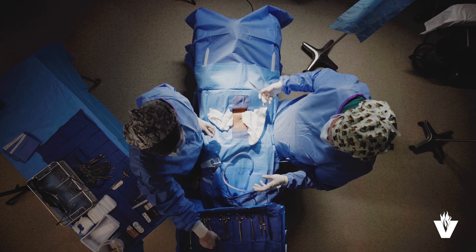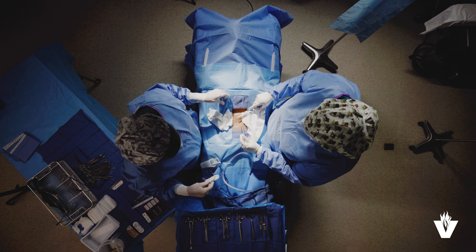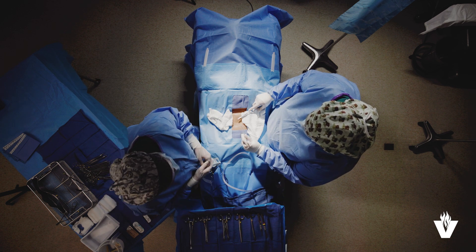You count instruments when the body cavity is opened or has the potential to be opened. You will do the closing count when the surgeon is suturing up a wound or a body cavity.